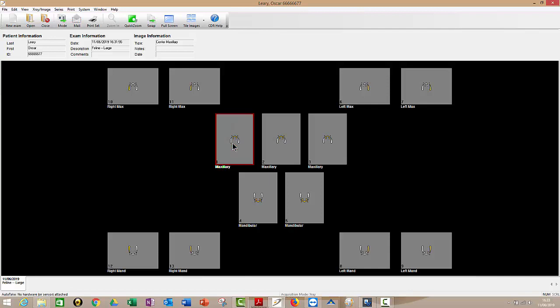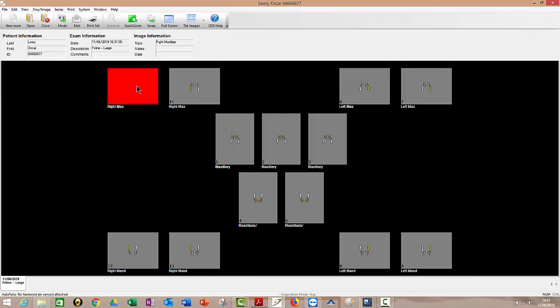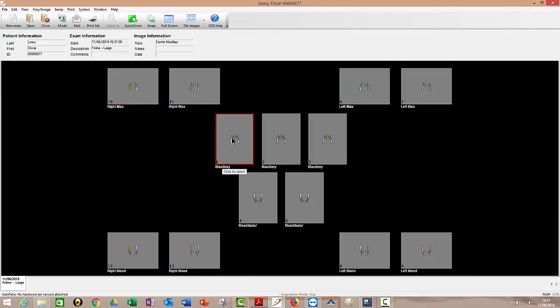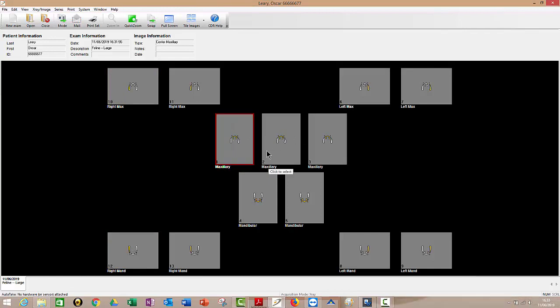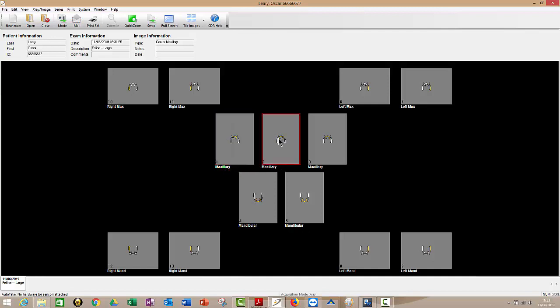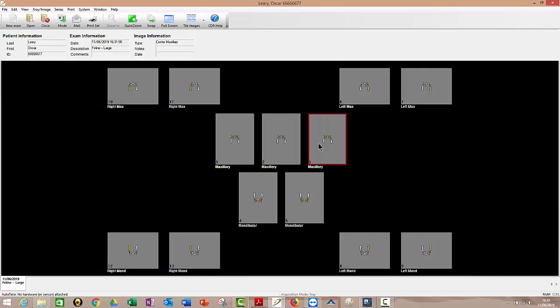I don't have to do that, of course, I can override it just by double clicking. I'm just double clicking with my mouse in a different box here. But assuming that I did want to do this one. So this would be, do you see, it's telling me, the gold area tells me this is the upper anterior. It's maxillary, anterior region. And it would put the image in there for me, and then box two would be flashing. And then if I fired again, the image would capture into box two, and then box three would be flashing. Do you see?